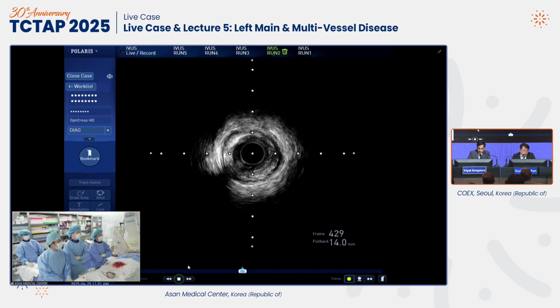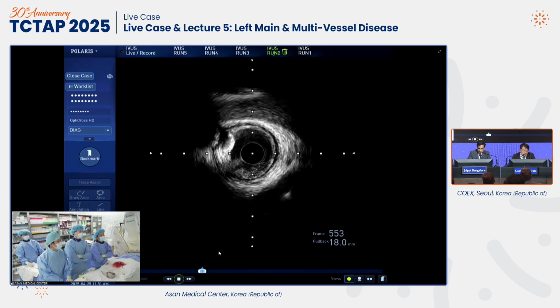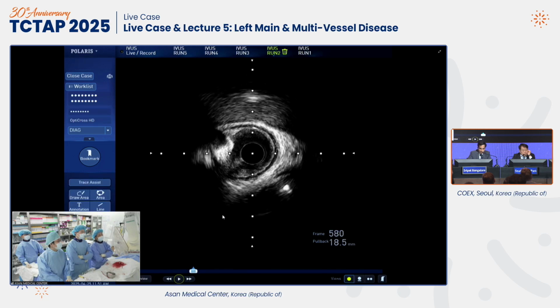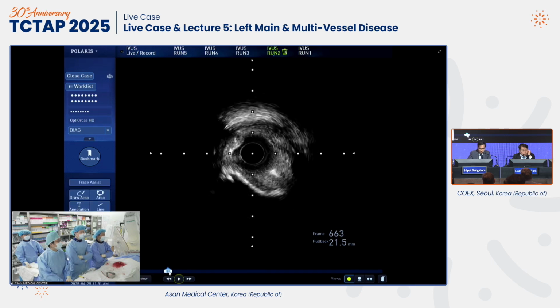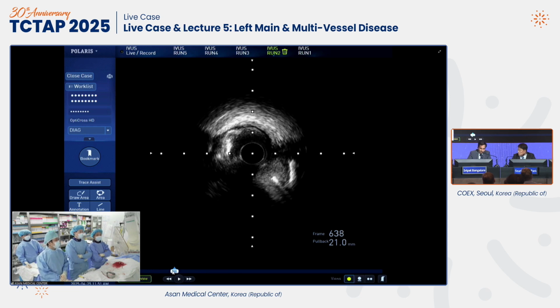Here is the tightest region, as you see in the angiography, with the calcification. And this is calcium. The opening of the diagonal branch to the LAD, I think there's some negative remodeling, however it's quite preserved. I think the IVUS is making many things clear here compared to angiography, because it's very clear. Even the ostium of the diagonal is severe.